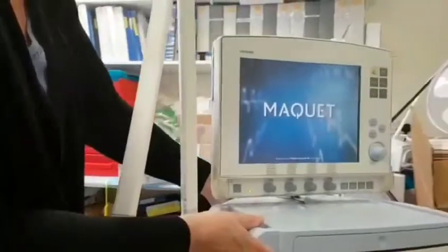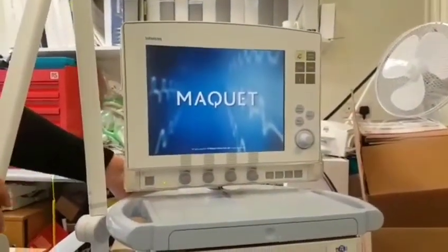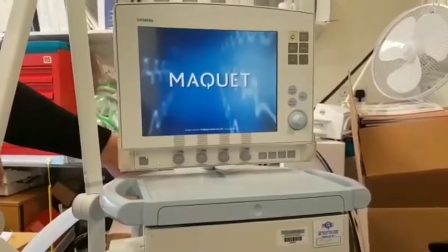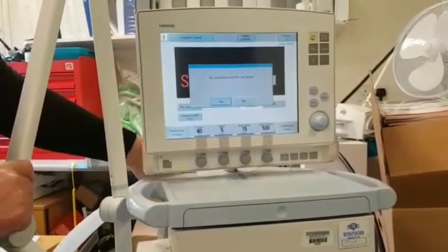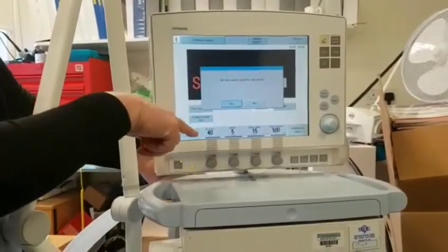If you have to do a hard start-up, then you will have to repeat the pre-use check just to check the ventilator. When it's done its self-check, it will ask, do you want to start the pre-use check? And then you would have to say yes and go through the cycle again.